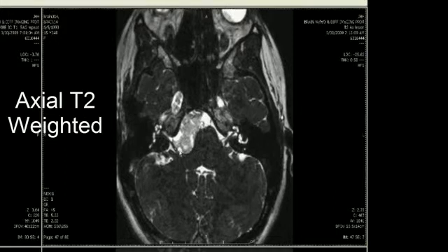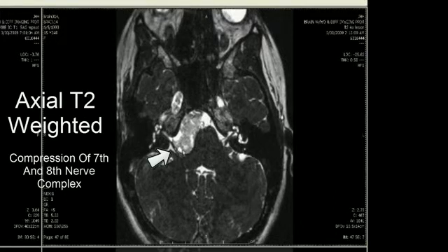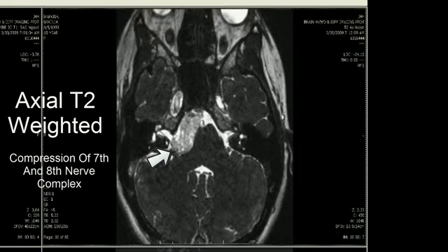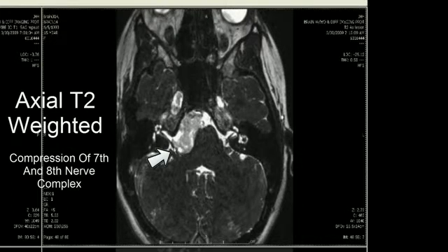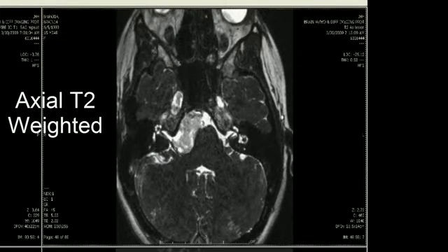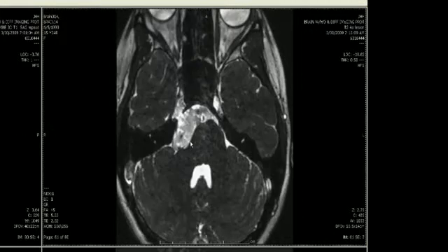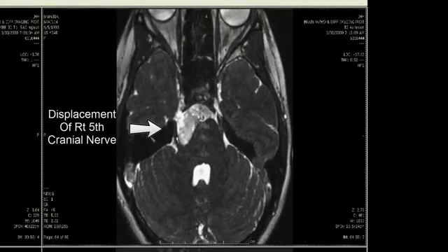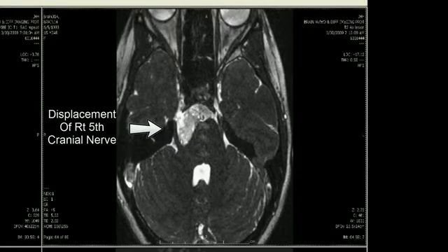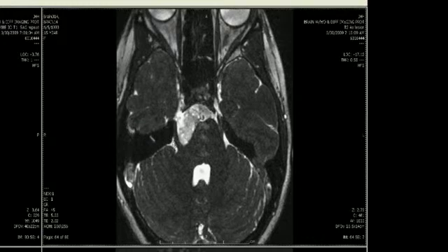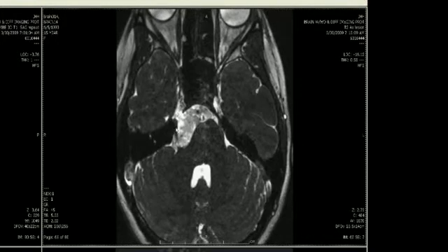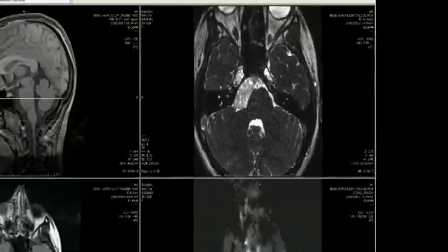The mass extends to the cerebellopontine angle cistern, where we can see compression of the 7th and 8th nerve complex extending to the internal auditory canal. As we continue further superiorly, we also note the displacement of the right 5th cranial nerve by the mass, with lateral displacement of the nerve extending to the Meckel's cave region.